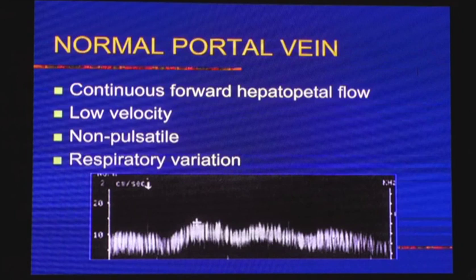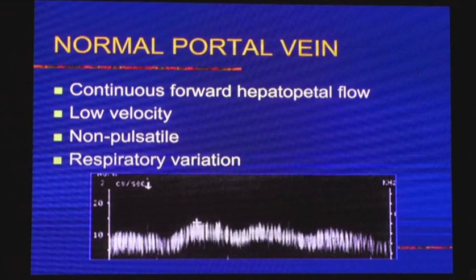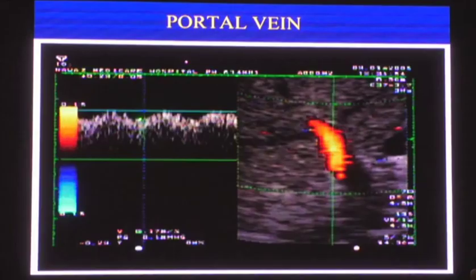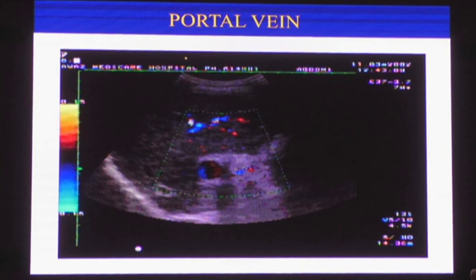Normal portal vein shows continuous forward flow — that is hepatopetal flow, meaning flow going towards the liver. Flow going away from the liver is hepatofugal. The portal vein is low velocity, non-pulsatile, with respiratory variations called phasicity. Velocity variations in hepatic and portal vein secondary to cardiac activity are called periodicity. You can see the dipping in the portal vein waveform — this is venous flow, not arterial, but the dipping represents transmitted waves from the hepatic artery and hepatic vein waveform.